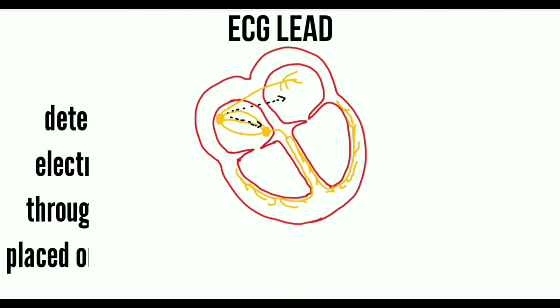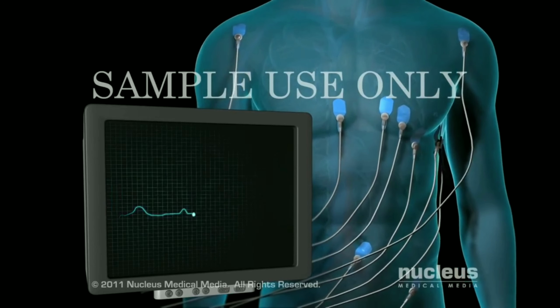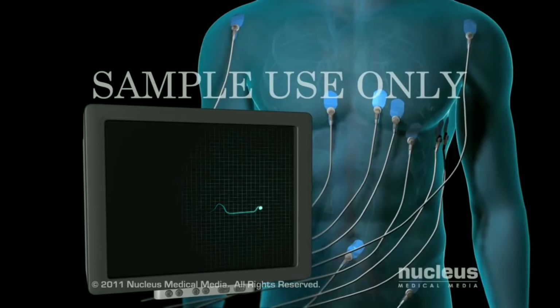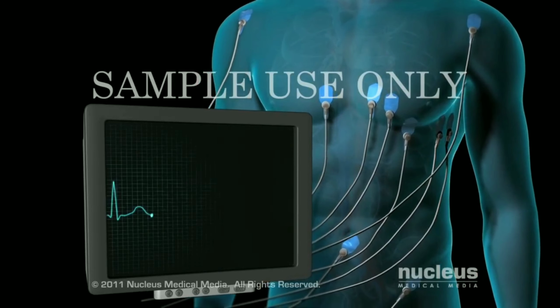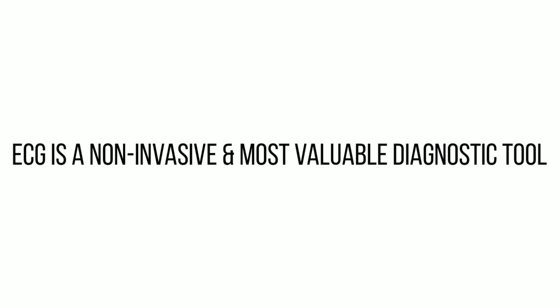During the activation of myocardium, electrical impulses or action potentials are propagated in various directions. These electrical forces can be picked up from the surface of the body by means of an electrode and recorded in the form of an ECG, or electrocardiograph. Now, ECG is a non-invasive yet most valuable diagnostic tool.